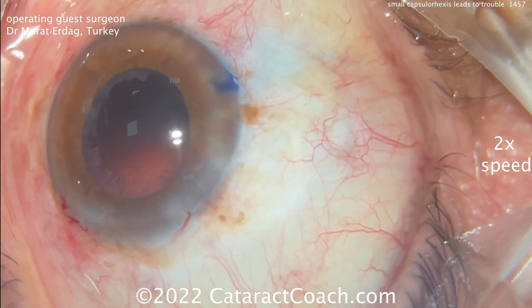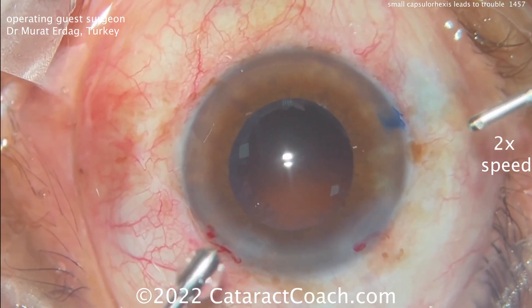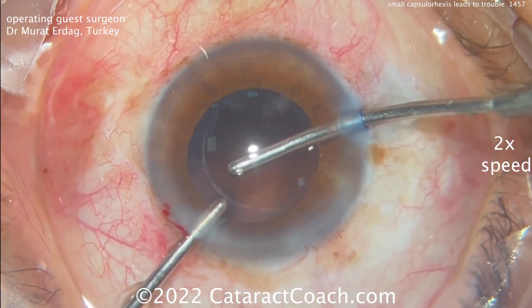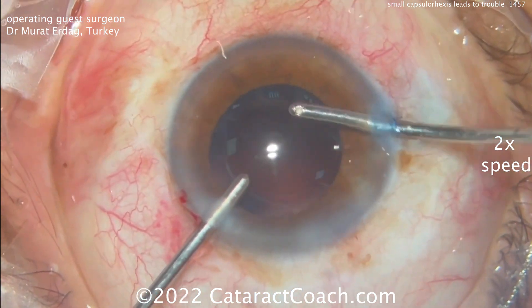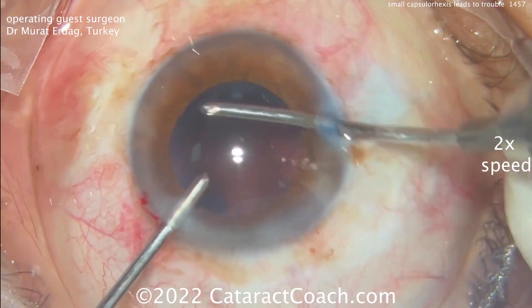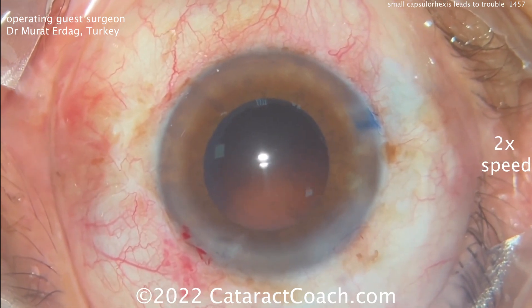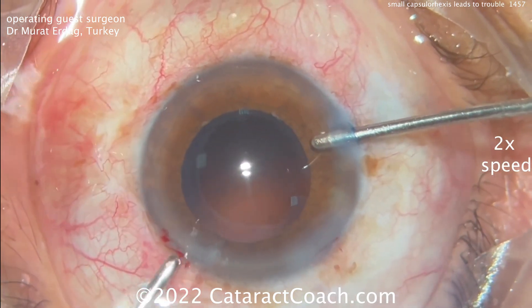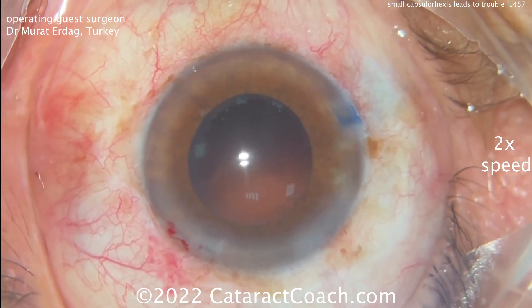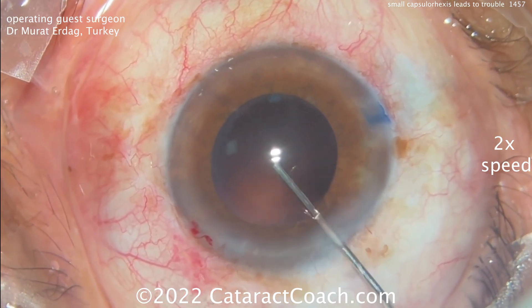Now how do you finish the case? There's still lens cortex in the eye to remove. It looks like a bimanual approach — do that sub-incisional area last. Going to the other areas first is a good idea. With bimanual irrigation-aspiration you have full access and can split the handpieces and switch hands. Now switching hands, but that sub-incisional space is where the Rhexis ran out or ripped, and you have to be very careful there.